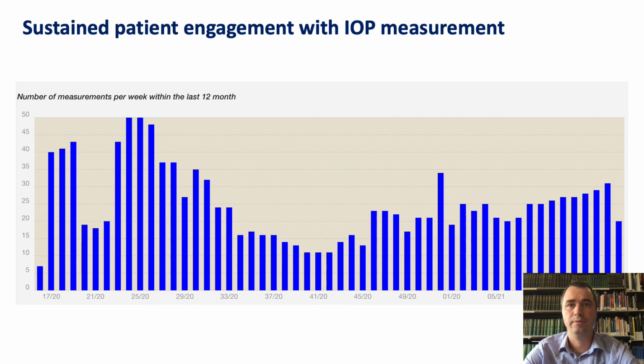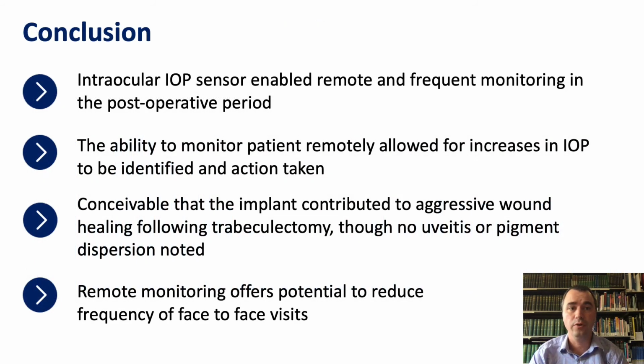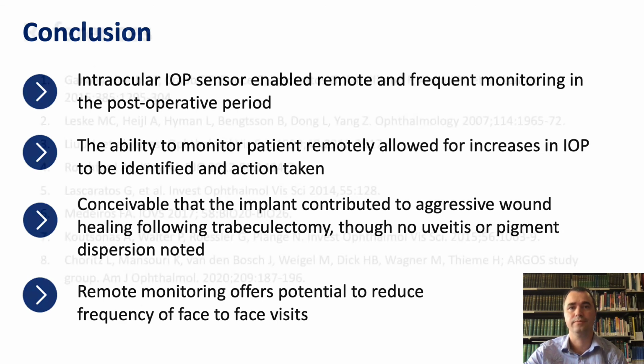So in conclusion, the IOP sensor enabled remote and frequent monitoring in the post-operative period. The ability to monitor the patient remotely allowed for increases in IOP to be identified and appropriate action taken. And lastly, remote monitoring offers the potential to reduce the frequency of face-to-face visits.